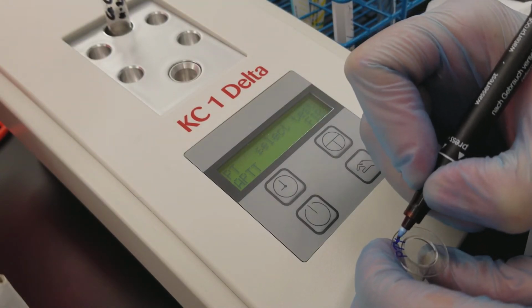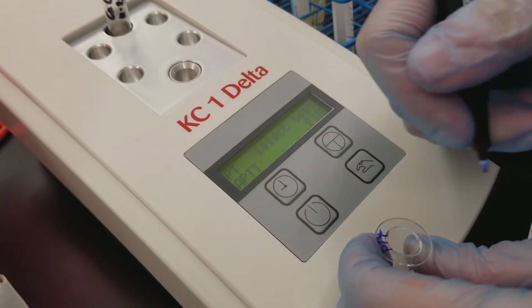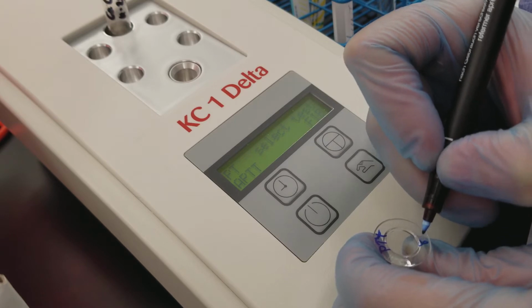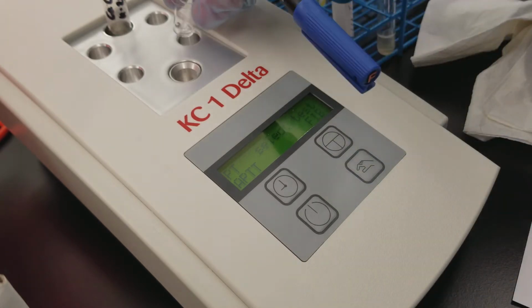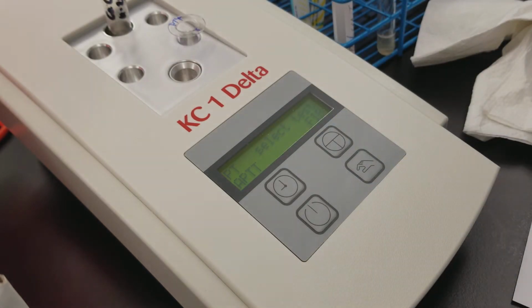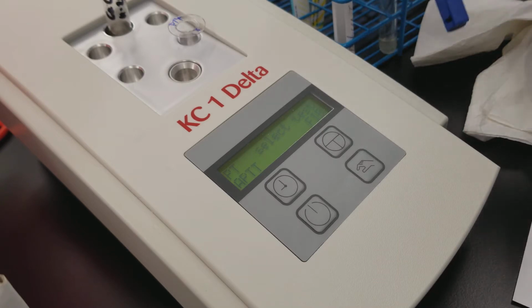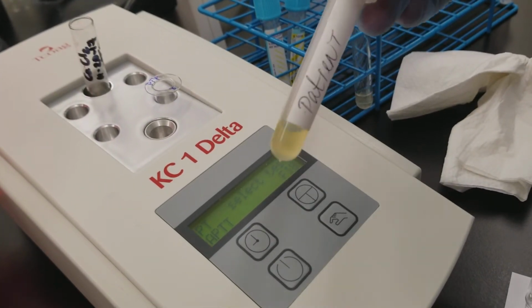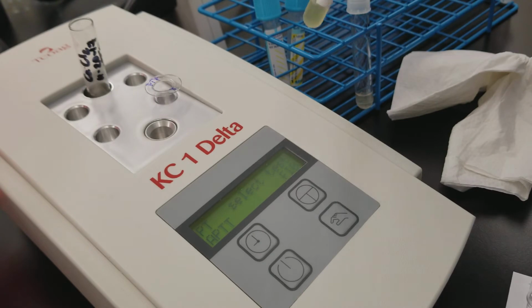I had a lot of fun talking with you about the methodology of this. So we're going to do a testing on patient 8 for the PTT testing, and we'll also do this patient too, and we'll see the difference between the two of them. Patient 8 seems like it's actually clotted already. Oh, you can't see anything. Patient 8 seems like it's actually clotted already. So we'll see the difference in results.